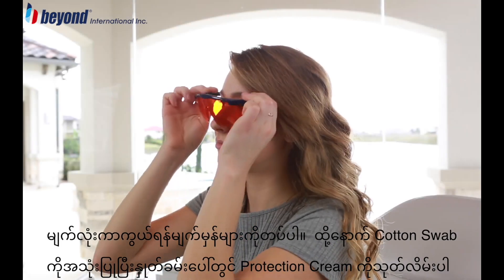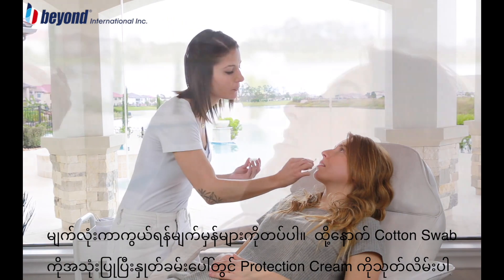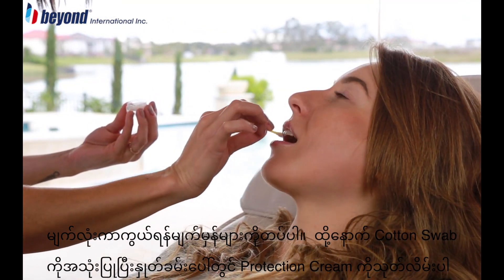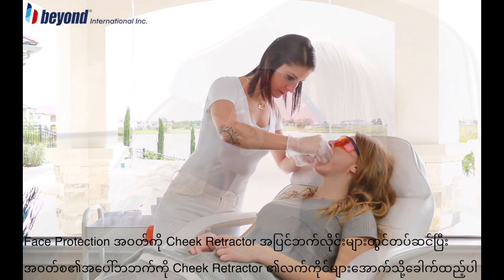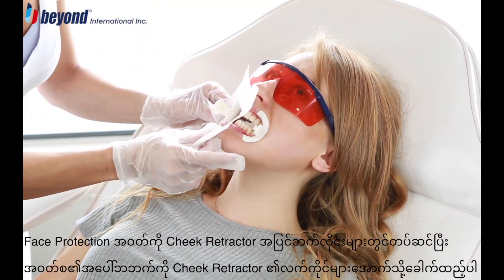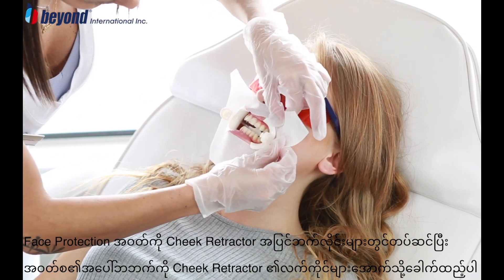Put on the protective eye goggles and apply a generous layer of lip protection cream using a cotton swab. Insert the Beyond 2 cheek retractor with the tongue guard pointing down. Stretch the face protection cloth around the outer rims of the cheek retractor and fold the top down under the arms of the cheek retractor.